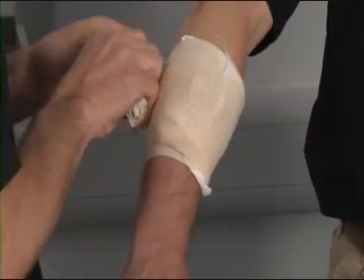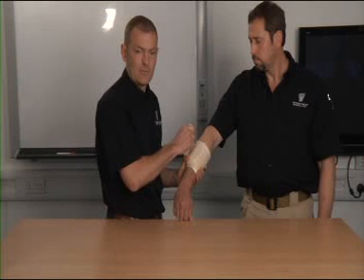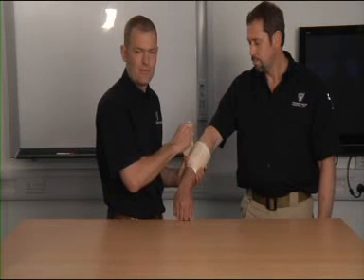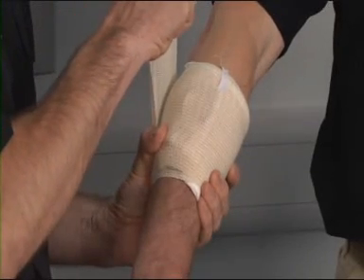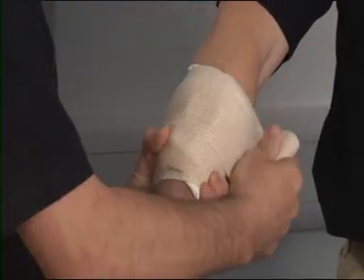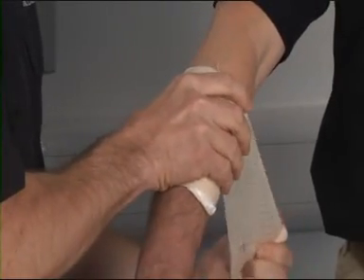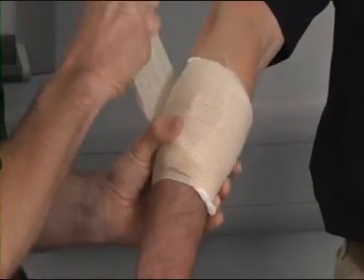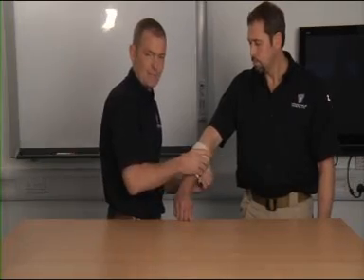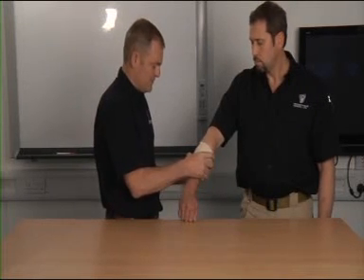As I'm putting the bandage on, like any elastic bandage where I want to gain maximum pressure — because pressure is important for controlling bleeding — I'm pulling the bandage to the extent of its elasticity and then wrapping, then unravelling a few centimetres, pulling it to the end of its elasticity again and wrapping, so that very easily we're getting the maximum effect from the elastic nature of the material.